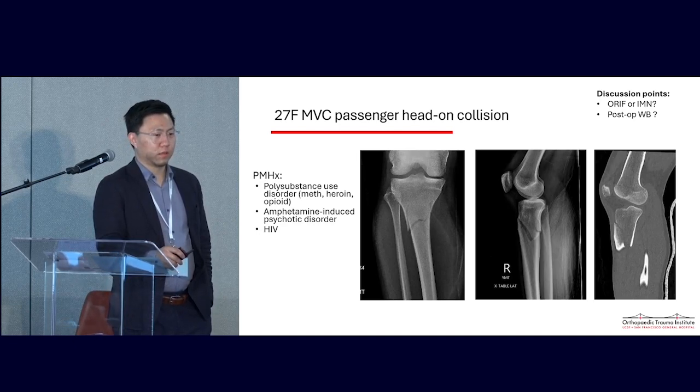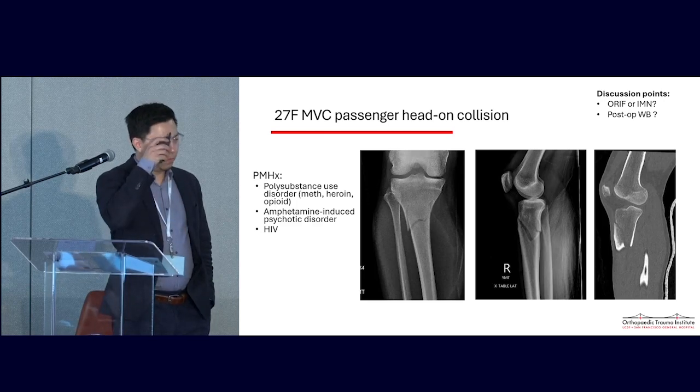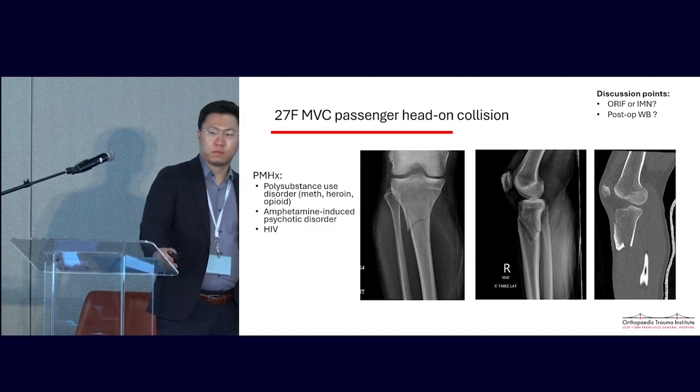So one thing nobody talked about, the fibula is intact. And I think that if you're considering plate fixation, that's a plus. Yeah, I agree. But on the other hand, the failure rate was a little bit higher. So a couple of platers, but mainly nails.